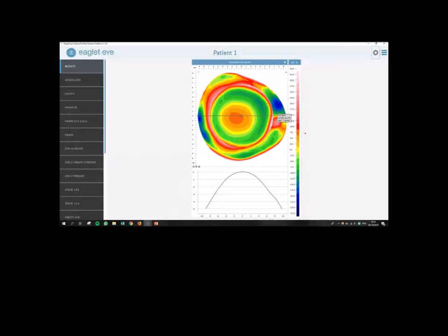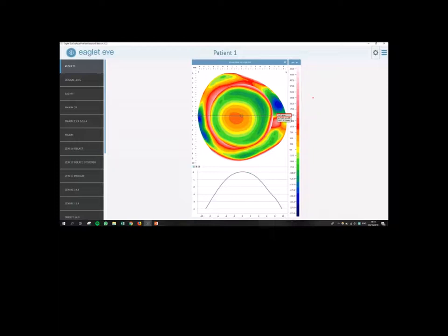So in case of ordering a microvault lenses, a lens with a microvault, I need some information. I need to know where the exact location is. I need to know how high this pinguecula is. So if you look at this little box over here, right on top, it says 217. So the height of this microvault is 217 micron. So if I'm going to order a microvault, I want to have it at a height of 217. Just because you want to lay it over and a pinguecula is a soft tissue, we recommend to subtract about 50 microns just to make sure it's nicely laying over the pinguecula. So in this case, we would probably order it at 160 microns high.